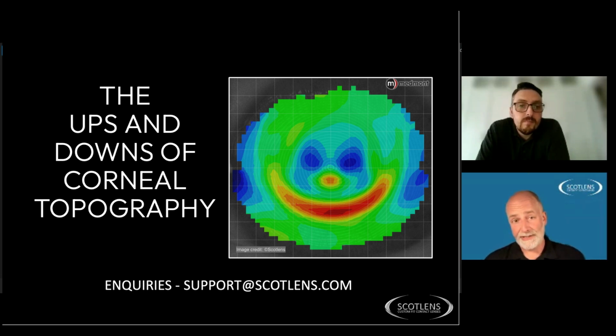Of course, he started when he was 5. He's now 18, I think, or 19. But he continued that with his mum's help until he was about 14 or 15 years old. His brother, who'd started when he was 7, just did everything himself from day one. Because they're 11mm gas perm lenses, they're quite easy to handle. They're a lot smaller than a soft, because they're actual lens rather than a bit of a wet cling film. Effectively, they're much easier to apply and remove. So handling is a lot easier with kids.